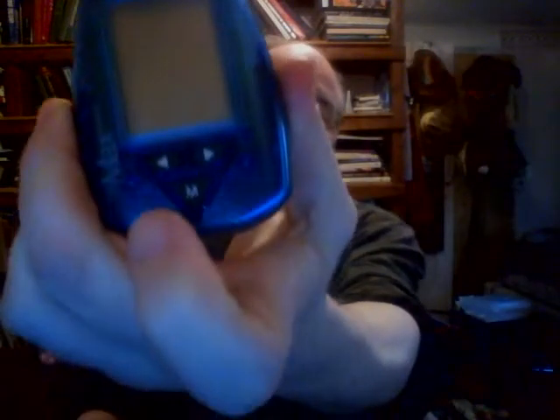Then you take this, which is a Nova Max Plus tester. You take one of these, which is a testing strip — they come in packages of like 50 or 100. These are kind of expensive; it's one of the things you need insurance for.